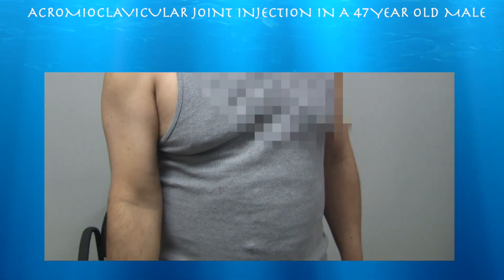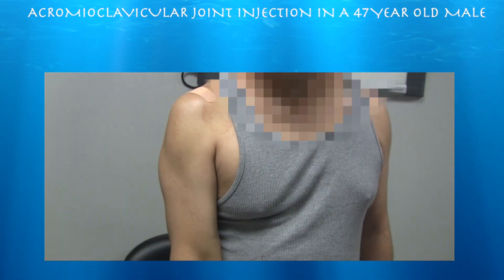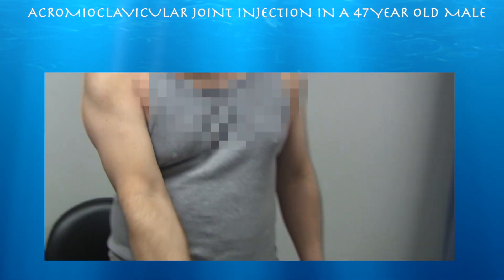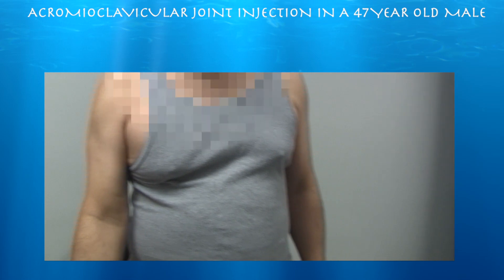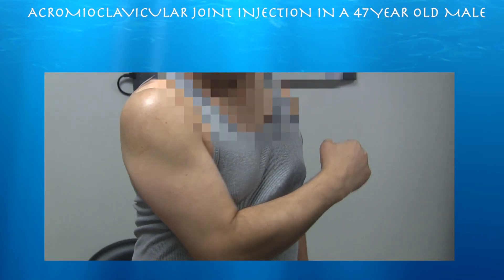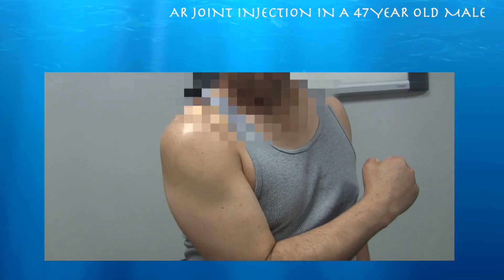¿Mueve? ¿Te duele? ¿El lado? ¿Para arriba? ¿Tú un poquito mejor? ¿Hace algo que te duele? ¿Menos dolor? — Menos. — Menos dolor. Less pain. Okay.